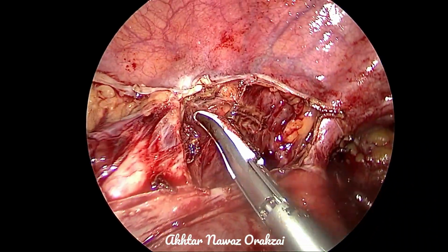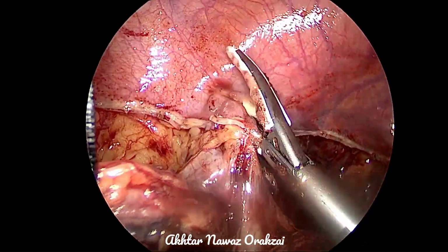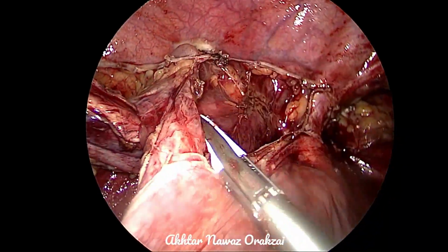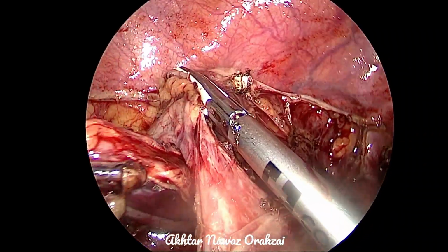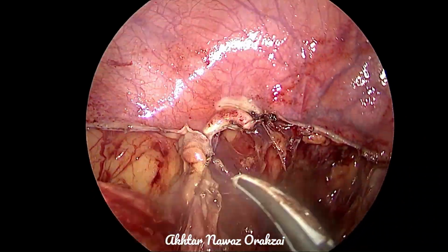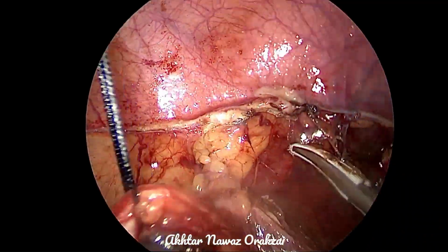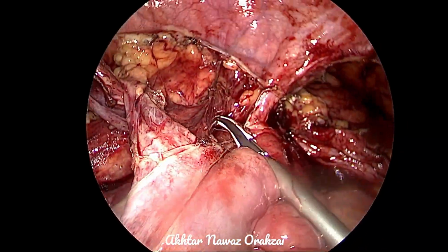So all this complex will be mobilized from the lateral pelvic wall, so it will come medially and give us some space. And this space will then be used to retract and pull the bladder, and fix it to the psoas muscle, the fascia of the psoas muscle. Care must be taken not to injure the external iliac arteries.